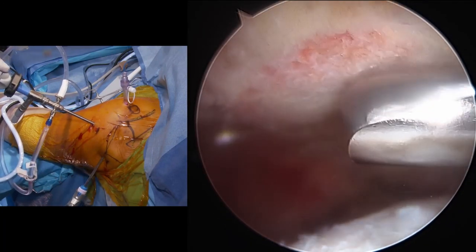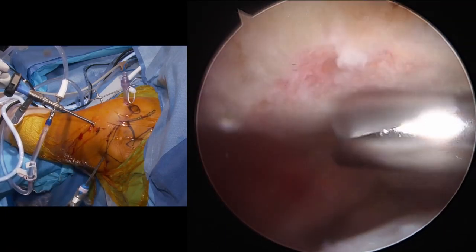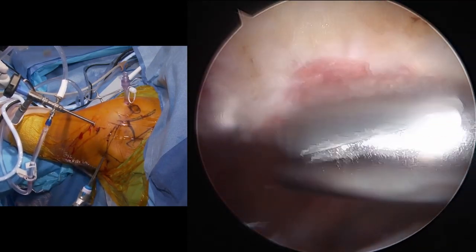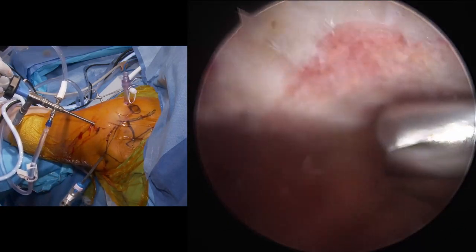So once we've taken off the lateral edge, then we'll come from posterior and we'll use the cutting block technique to finalize the acromioplasty. Trying to make that a perfectly flat surface or as close as we can.